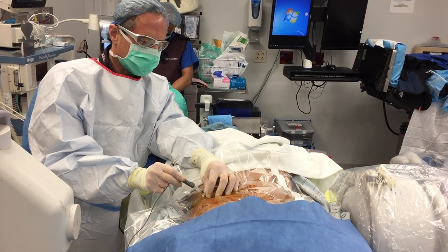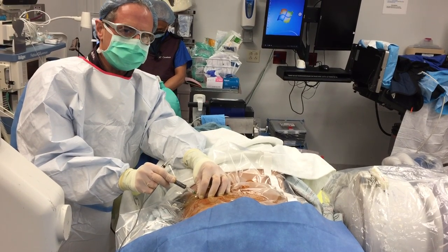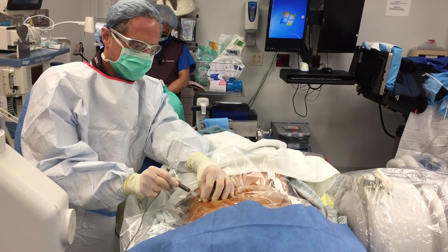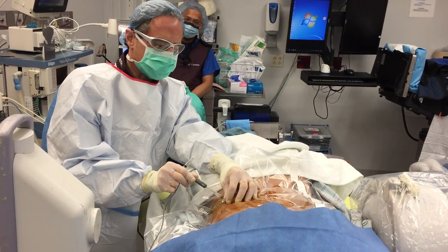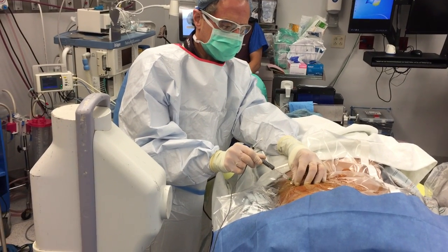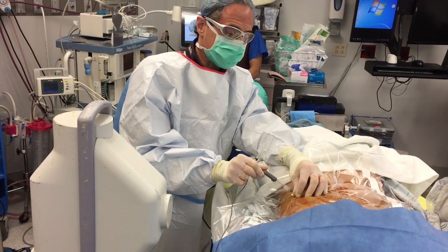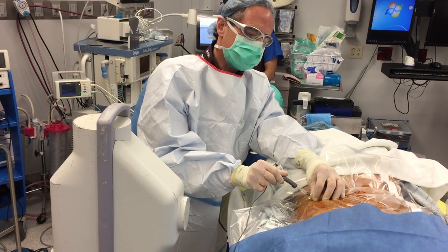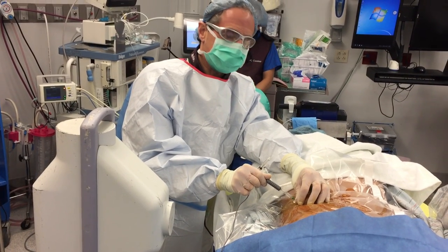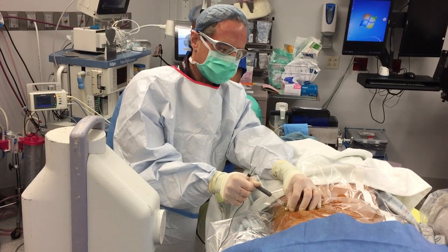We're just slowly going in and out of the disc and it will vaporize a little bit of tissue, and ultimately shrink the disc to help patients who have back pain and sciatica from a contained disc herniation. In the right patient it can help you avoid surgery. We always believe in doing minimally invasive first and avoiding surgery which can create problems down the road.